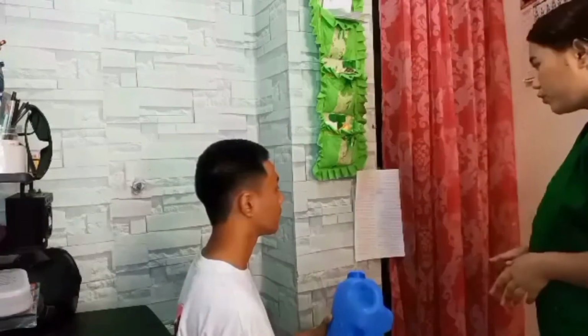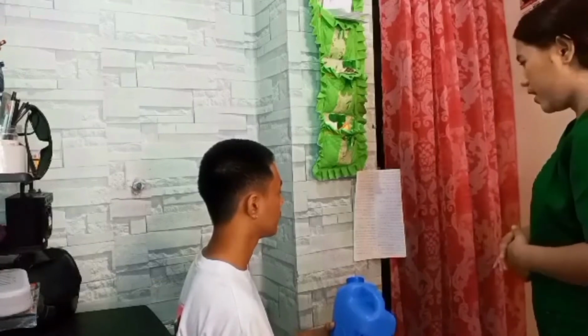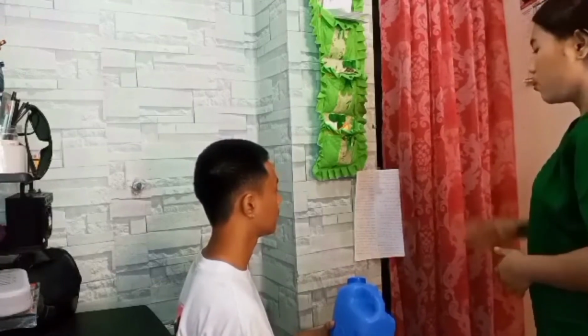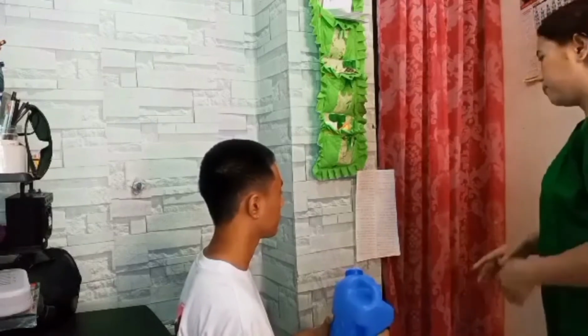Okay, so the following day, we will end the test at the time from the previous day that we started the test. Once the test ends, you're going to put the time on the container again.